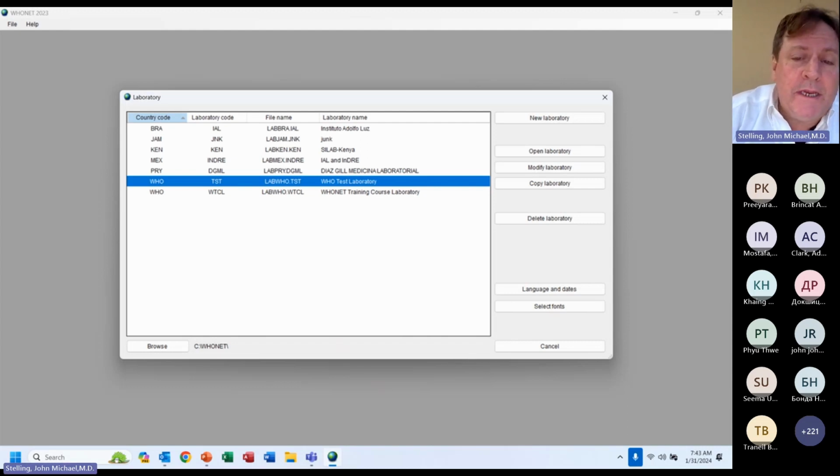The reason I am doing this is so that you can repeat what I am doing on your own. So I do not want to give you 5 years of data from my hospital. Of course, I'm not permitted to do that. So in our tutorials, in our teaching exercises, we do use the 1 month of sample data for purposes of teaching. Just keep in mind, there is a limitation. It is only 1 month of data, and normally you would like to have at least 1 year of data.